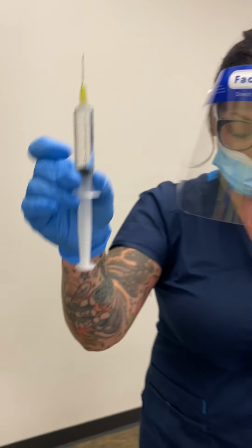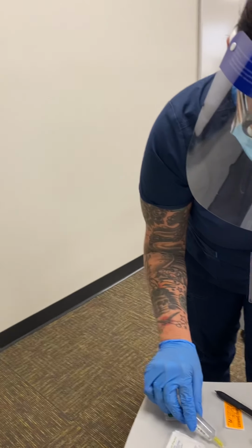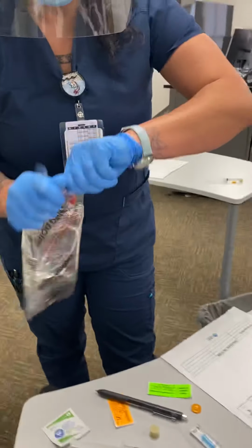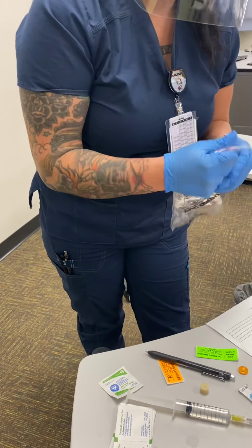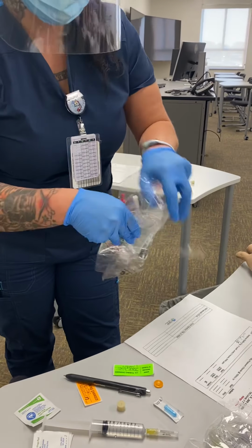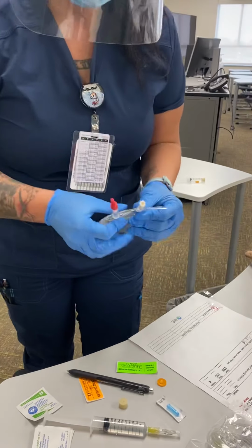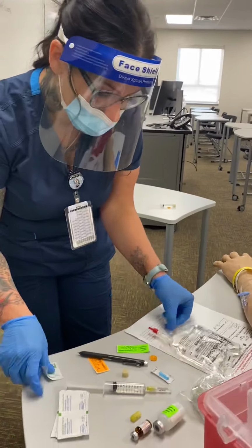Looks good. Okay. And just to keep that sterile, I'm going to recap. And open it. So second med check with the saline as well. I'm just making sure that it's the right amount, that it's not leaking. Color is good, and it does match my MAR. So I need to clean the port site.